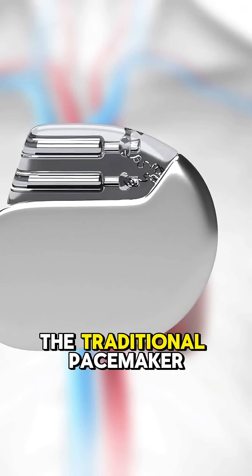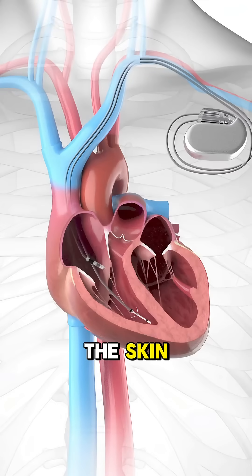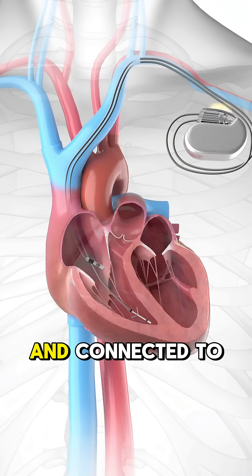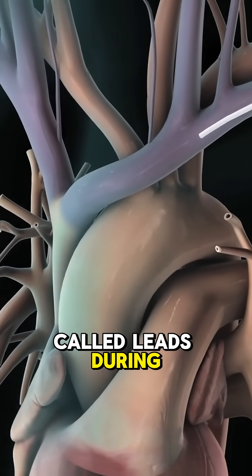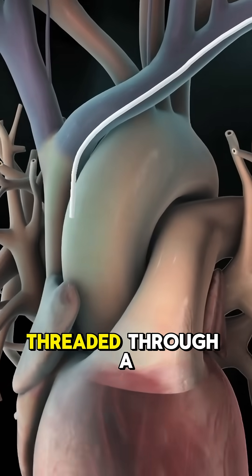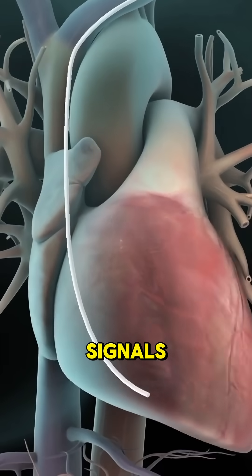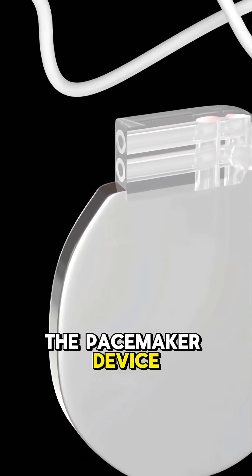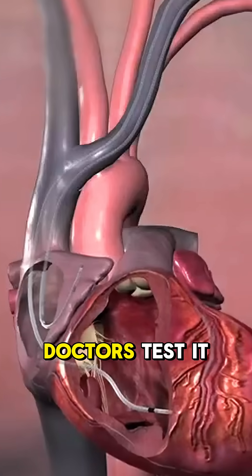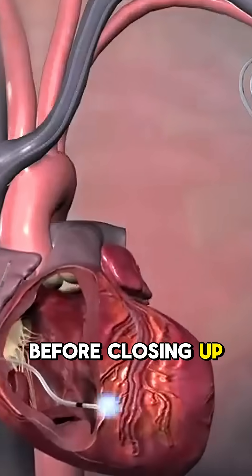First, the traditional pacemaker. It's a small device implanted under the skin, usually near the collarbone, and connected to the heart with thin wires called leads. During this procedure, a lead is threaded through a vein and placed inside the heart to deliver electrical signals. Once the lead is in place, the pacemaker device is connected and secured under the skin. Doctors test it to make sure everything is working perfectly before closing up.